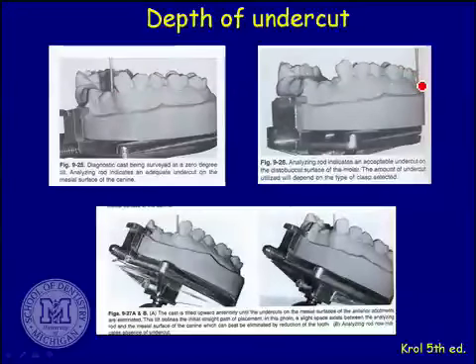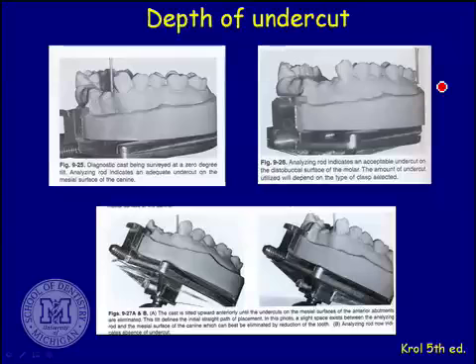Okay, would anybody care to tell me if I have a problem with that undercut right there, what's my problem? I want some undercut, that's a good thing. So I've got some undercut, but what's wrong with the nature of the undercut? Can you see that my height of contour is absolutely at my occlusal buccal corner? And I'd like the height of contour a little bit further down on the buccal of the tooth.